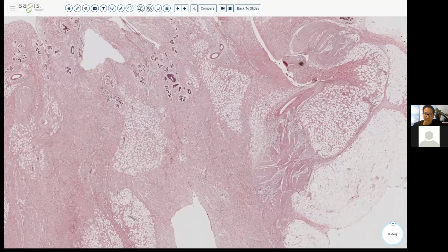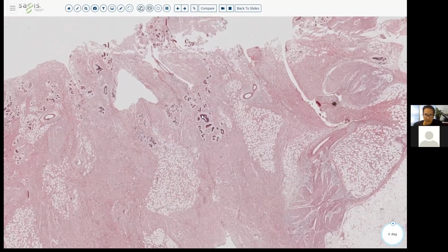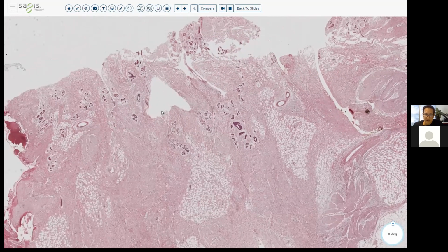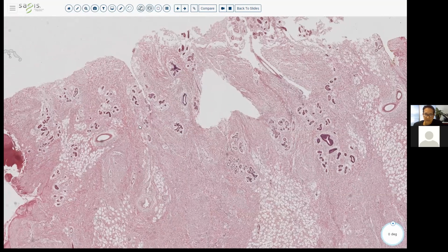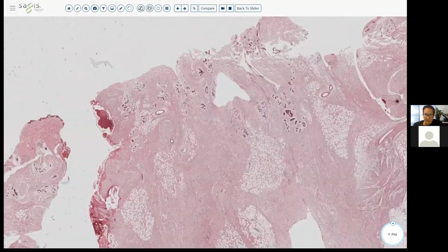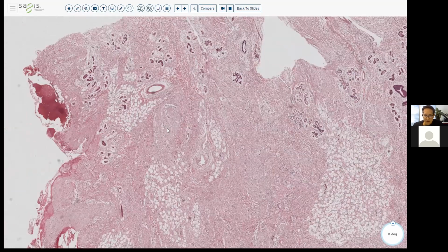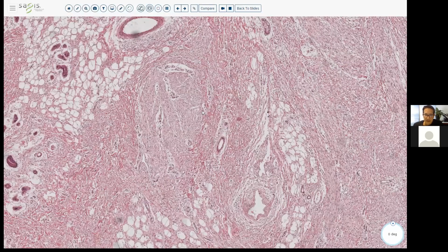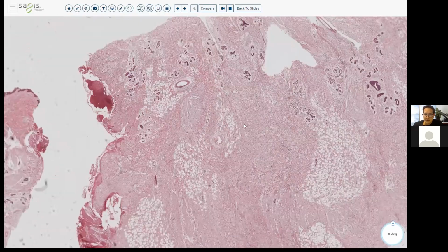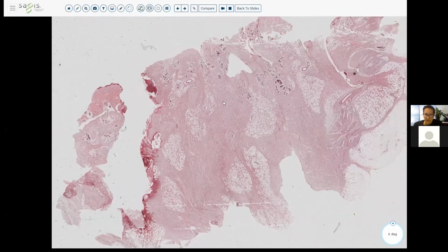Okay, you can actually see that within the lesion as well, you have some of the eccrine and apocrine ducts here, the sweat glands. But again, the cells should be monomorphous. They should be really hard to see because they're so small, so you have to zoom in to see the cells. There shouldn't be mitotic figures, and the history would help quite a bit on this. But this is a fibrous hamartoma of infancy.